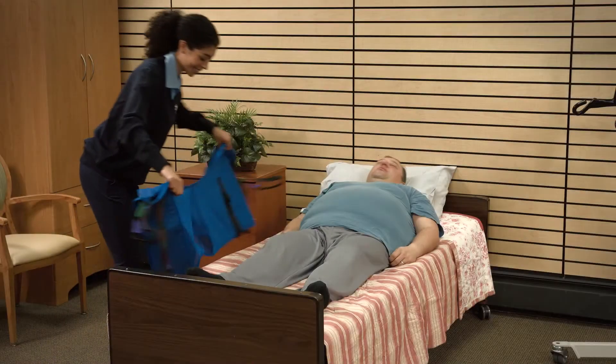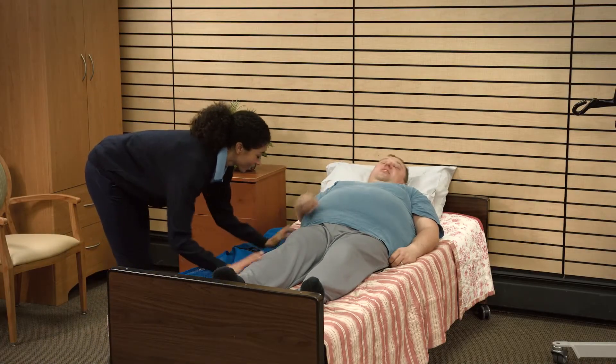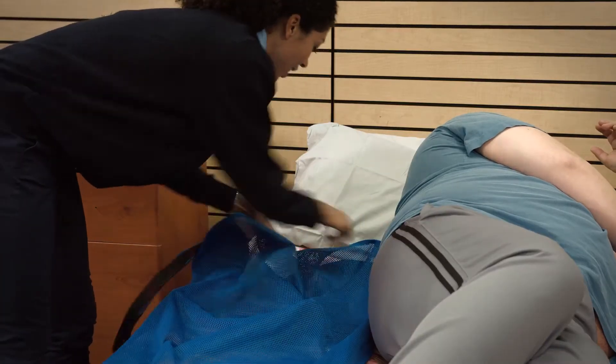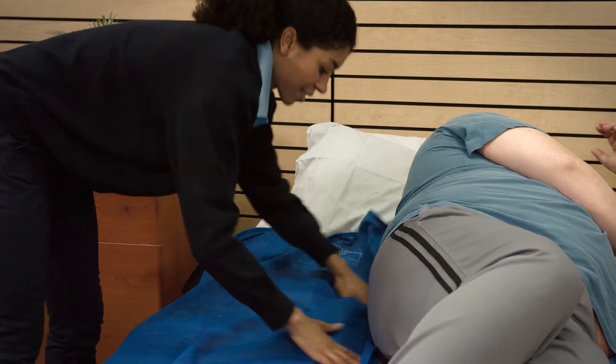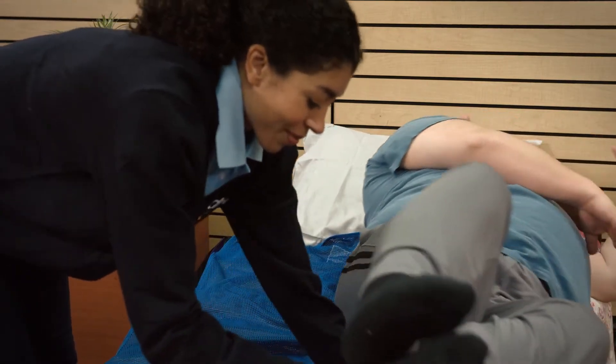After the sling is inspected, make sure that the sling is positioned correctly on the surface with the patient in the center of the bed. To position the patient correctly, roll the patient on the side away from the attendant. This will enable you to center the patient on the sling.